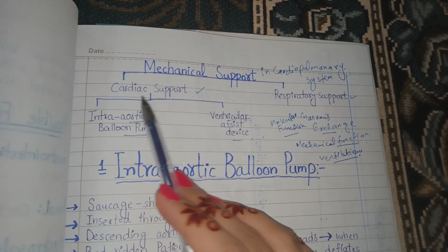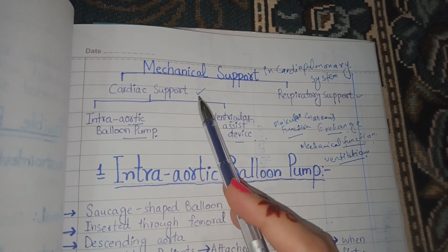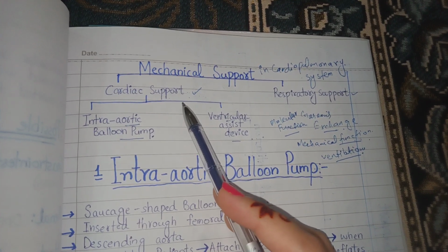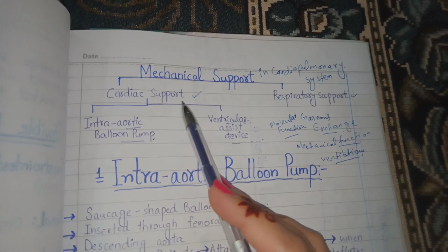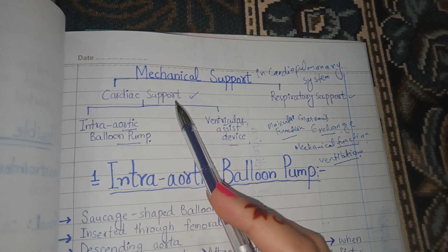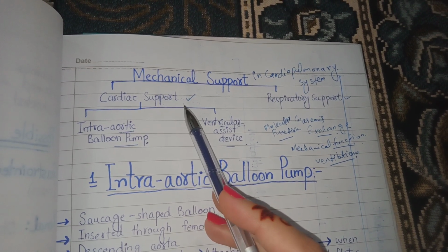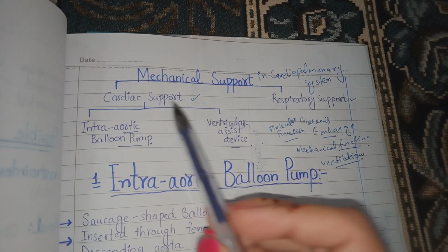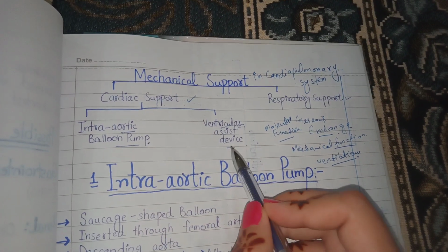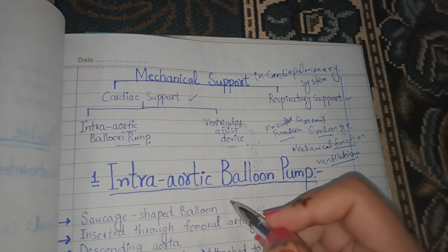Now, why do we need to give cardiac support to patients? We know that the function of the heart is to pump blood to the body. If for any reason the heart is not pumping blood towards the body or its function is disrupted, then we need to give cardiac support to the patient's body. Cardiac support includes any mechanical device that we attach to the body so that the heart pumps blood to the body and we can stay alive. There are two types of cardiac support: the intra-aortic balloon pump and the ventricular assist device. We will discuss both of these types in detail in further lectures.